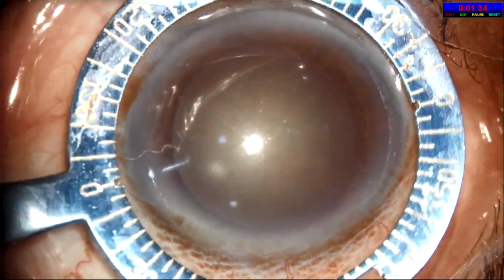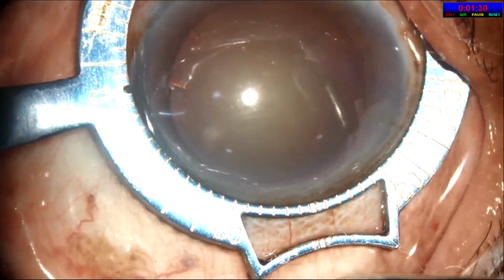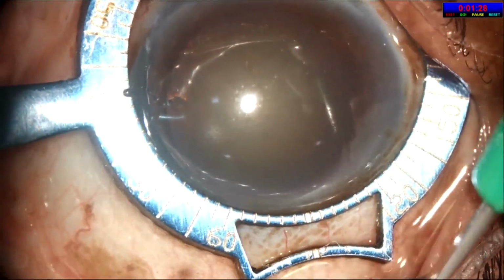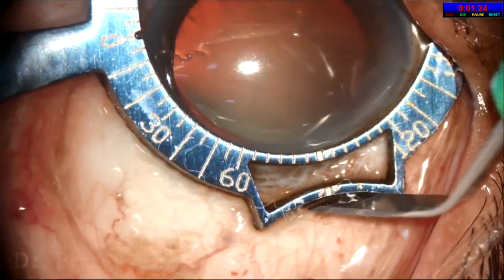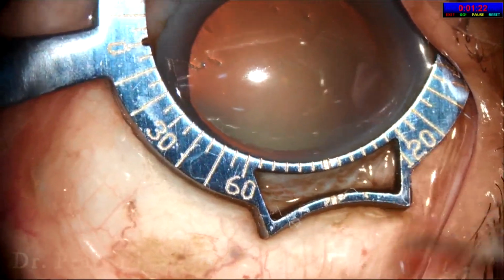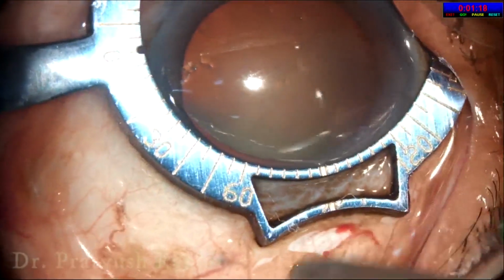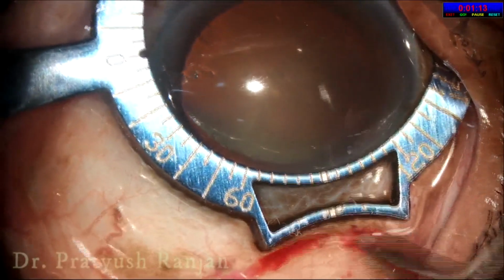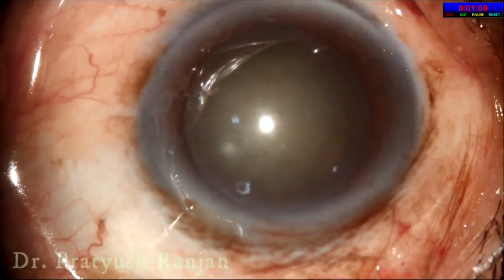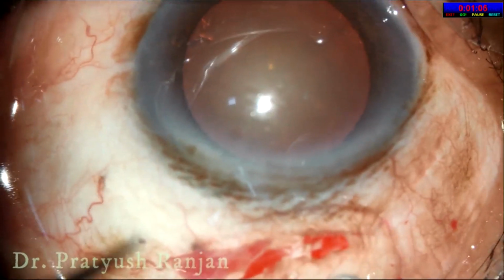It has a serrated edge which holds onto the globe, and now you have this stencil-like thing which will give you a frown-shaped incision of 6 mm. You can increase it, and the rest of the surgery is almost the same. So if you are not comfortable with a tooth forceps, topical Phaco, topical SICS, you can use Ranjan marker, and this would help you in creating a good tunnel. Thank you very much. I would appreciate any questions.